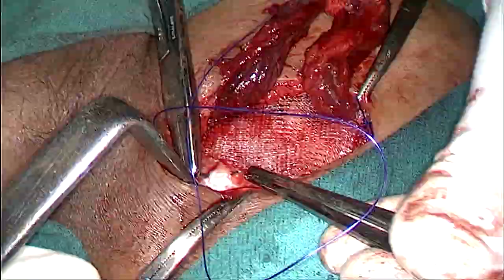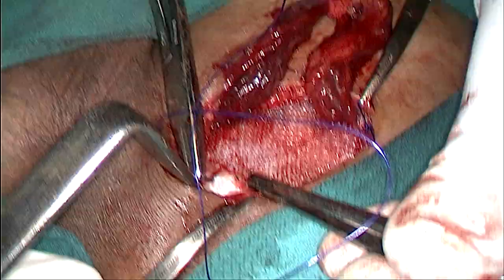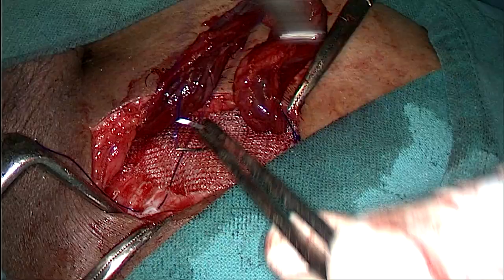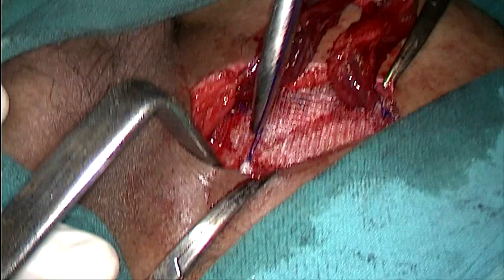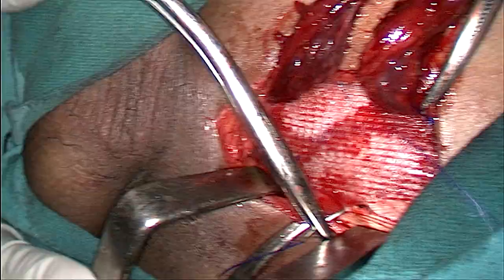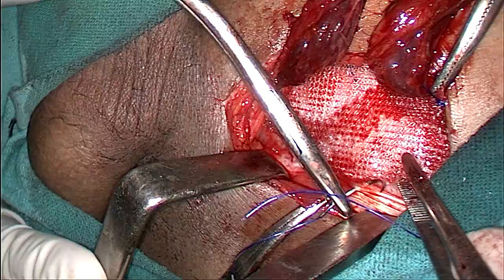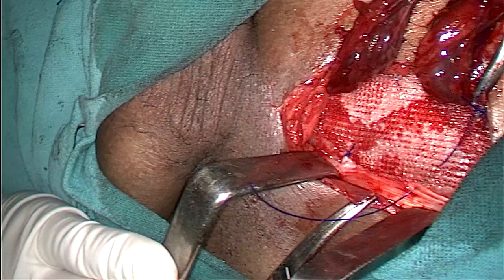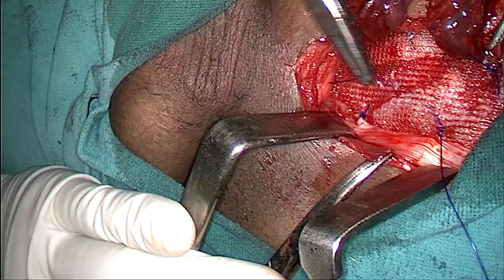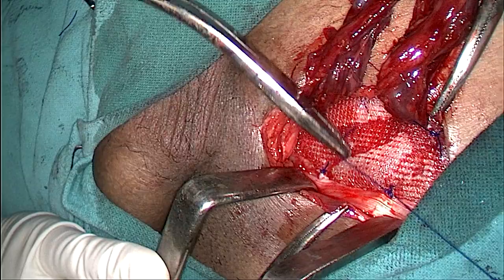I am taking a small bite of the lower lip of the external oblique aponeurosis and the edge of the mesh. Two or three sutures in this area will be considered enough, as we have taken two anchor sutures and three or four sutures at the lateral side — here two or three sutures are more than enough. Also try to avoid taking a large bite of the lower lip of the external oblique aponeurosis as it may cause a problem while repairing the flap. By this knot we just finish with the mesh fixation.